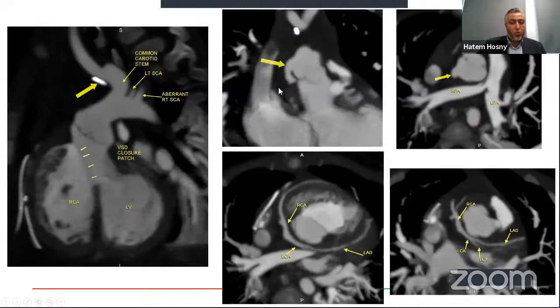The challenge here was also thinking about how to stop the heart and give cardioplegia, because with the usual manner, when we cross-clamp the aorta and then infuse cardioplegia into the root, this will not be supplying coronaries. So we had to transect the coronary artery high up near the carotid and then put a selective cannula inside the coronary, and infuse cardioplegia in that. Then we went ahead, repaired the truncus, which is closing the VSD by a patch and reconnecting the pulmonary arteries onto the RV, and then re-implanting this coronary into the new root.